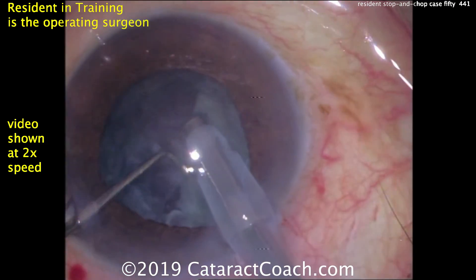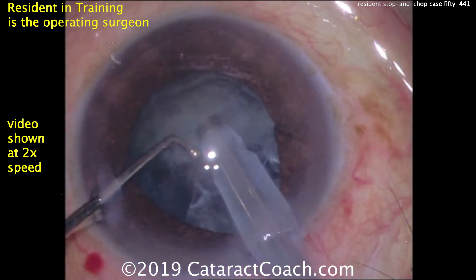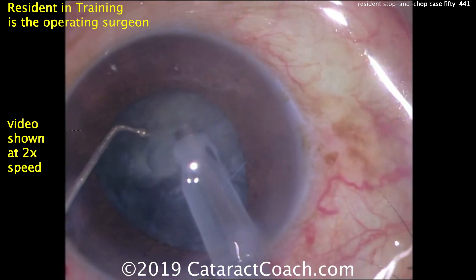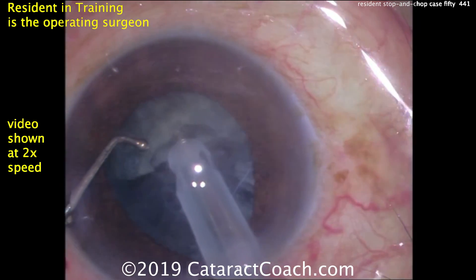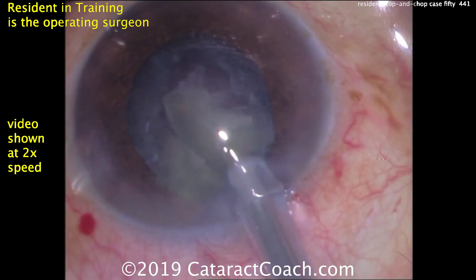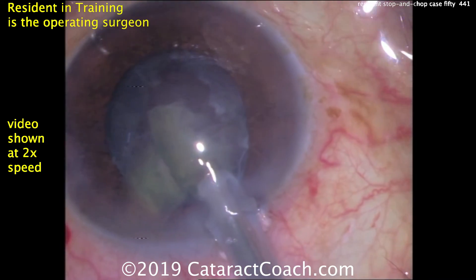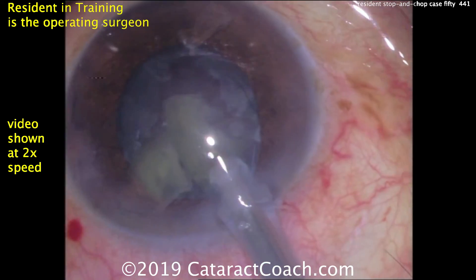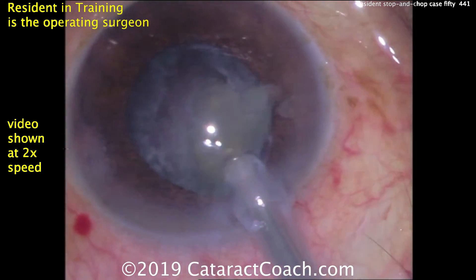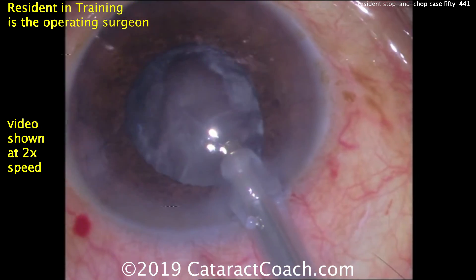Buzzing into the second hemi-nucleus — let's look at the chopper placement. Chopper goes around the equator, that looks great. Now look at the chopper design: this chopper has a ball tip and is not a very sharp instrument, which goes to show you that with good technique you don't need a really sharp instrument. I prefer a chopper without the ball tip — I have much more control with a traditional style chopper — but this shows that technique is more important than the instrument.